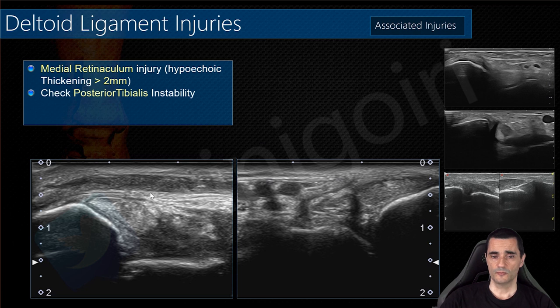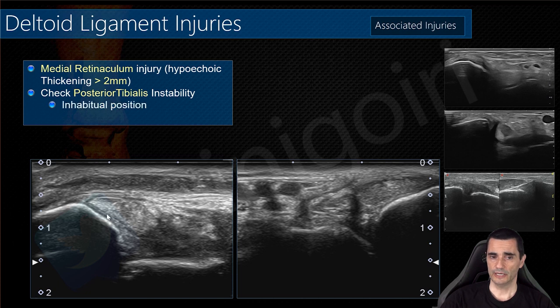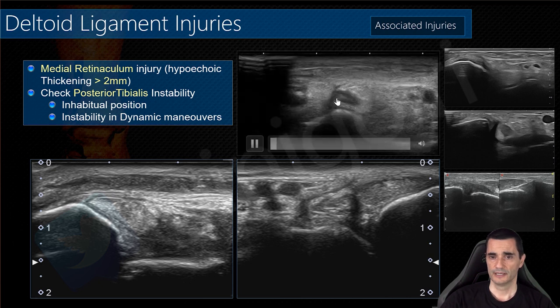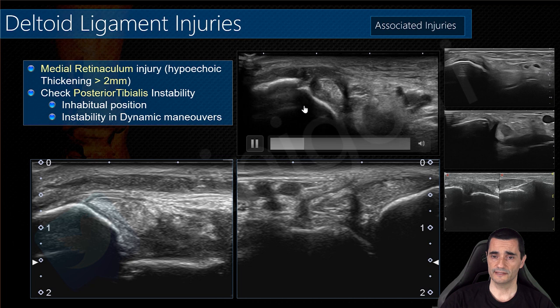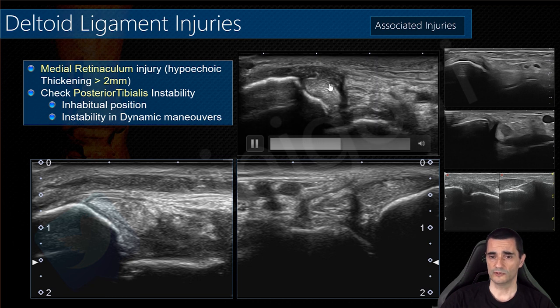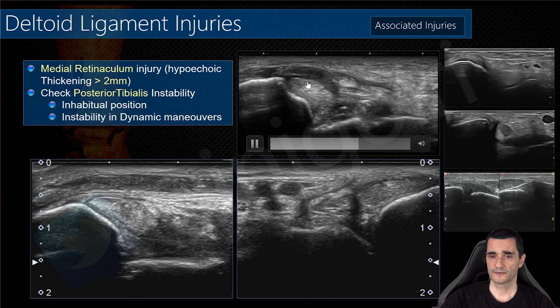It is important when the retinaculum is affected because you must always check for posterior tibialis instability. With dynamic maneuvers, check whether the posterior tibialis is not in its normal location or becomes luxated. This is an example of affection of the retinaculum with a normal posterior tibialis.